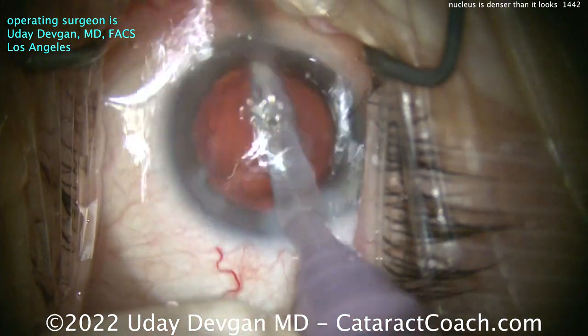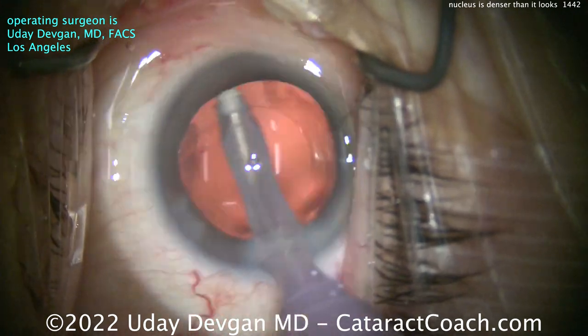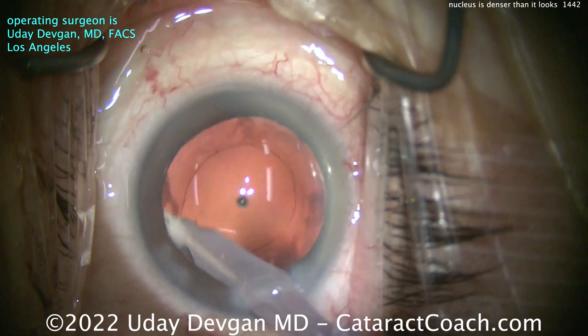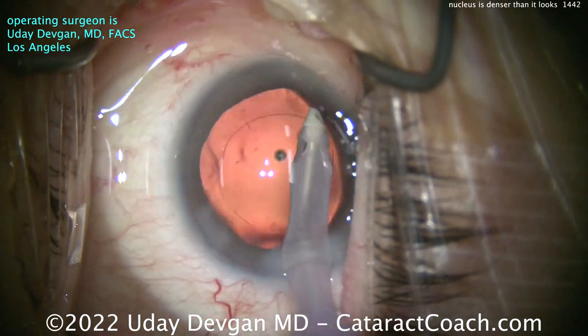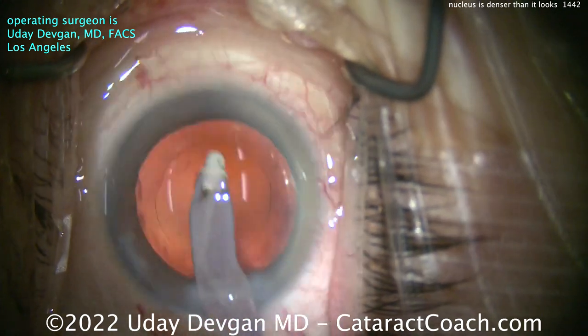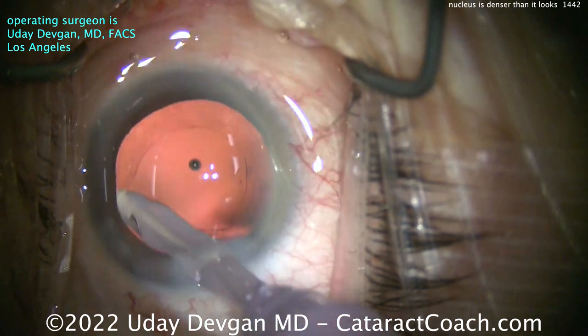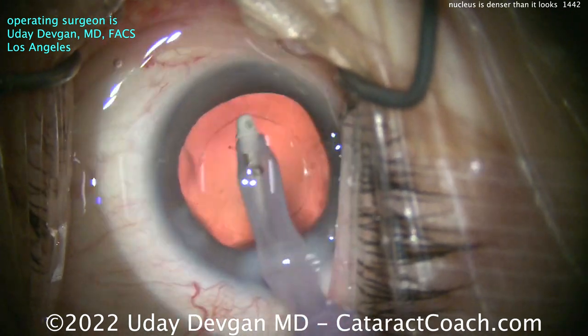Cleaning up the capsule pretty nicely. Let's do a little polishing of the undersurface of the anterior capsule rim. I'm still using the same phaco IA or cortex removal mode, and just using my foot pedal to modulate the amount of vacuum. That's cleaned up pretty nicely. We're not going to go overboard — we'll just take our time. Now we're ready to put the lens in.